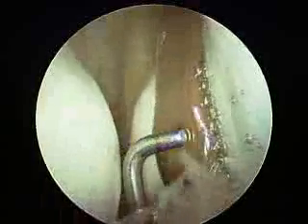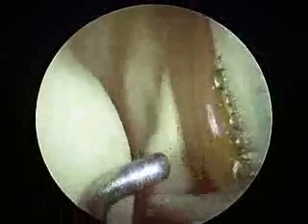Because when I first entered your knee joint, you had some, can we stop that? Okay, good. You had some loose bodies floating around, little pieces of crud that had come off somewhere, and I think they came off from the patella. It's just a bubble, actually. See, that's just a bubble. And I think the problem is right here. I think this stuff is catching under your kneecap and causing some snapping. So we're going to shave that away.